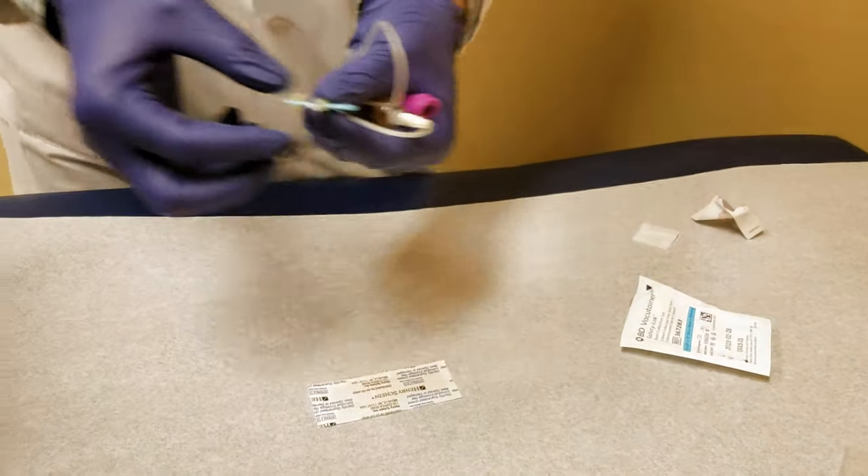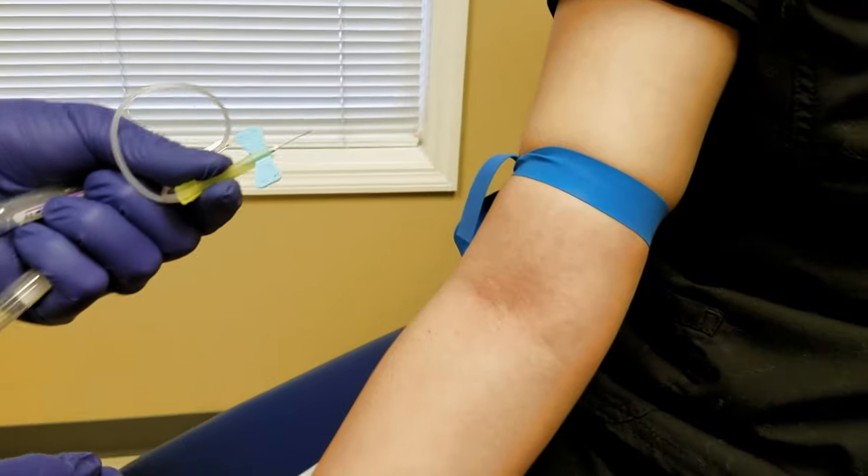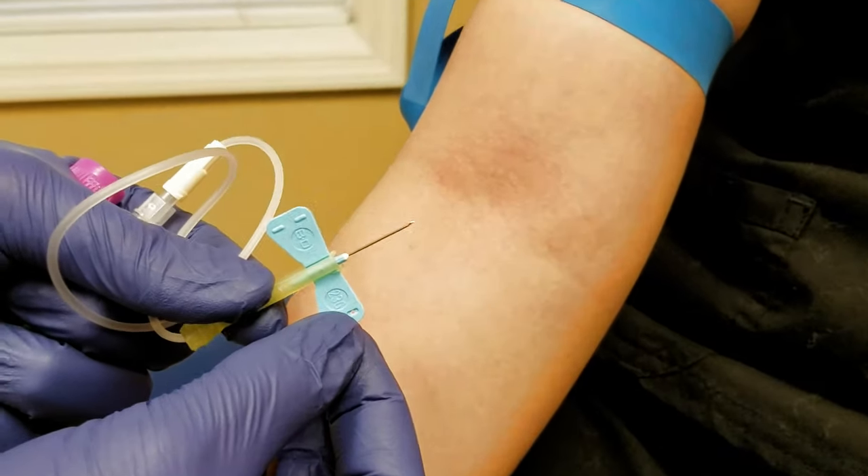Come back over here, pull the little protector off the needle and toss it to the side. Then see if you can zoom in to see the bevel on the needle.